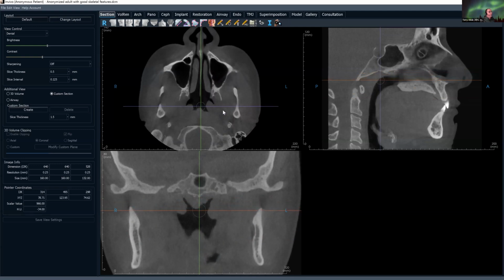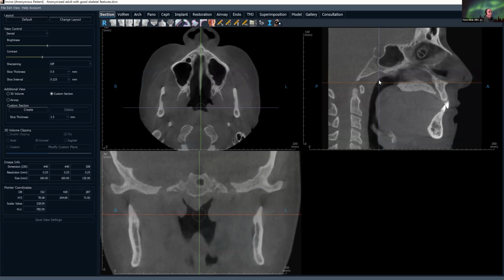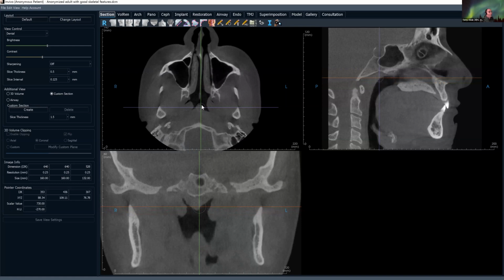So now I'm focusing on the axial plane in the upper left. This may not be the best example because the adenoids are a little bit enlarged. We're going to look for these familiar soft tissue landmarks, in this case, the torus tubarius. And superior to that, or anterior in the upright patient, this is the eustachian tube canals right in here. And then as we scroll more inferiorly, we don't see it very well. This is the fossa of Rosenmuller, or the posterior recess, and the adenoids are in here.